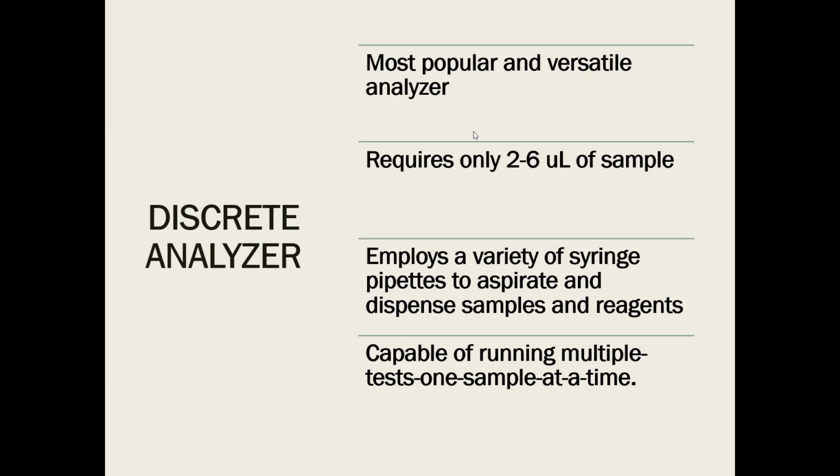Why is it popular? It has more functionalities and is capable of multiple testing at the same time, multiple testing of one sample. The earlier analyzers were capable of multiple testing, but only one analyte per sample. In the discrete analyzer, one sample can be tested for all analytes.